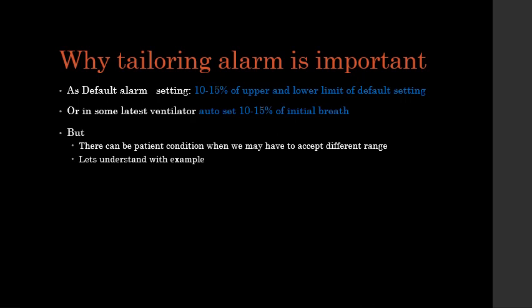And there are some new ventilators which take the initial few breaths of the patient as the baseline value, and the 10 to 15% lower and upper values are taken as the alarm limit. So this will happen normally.